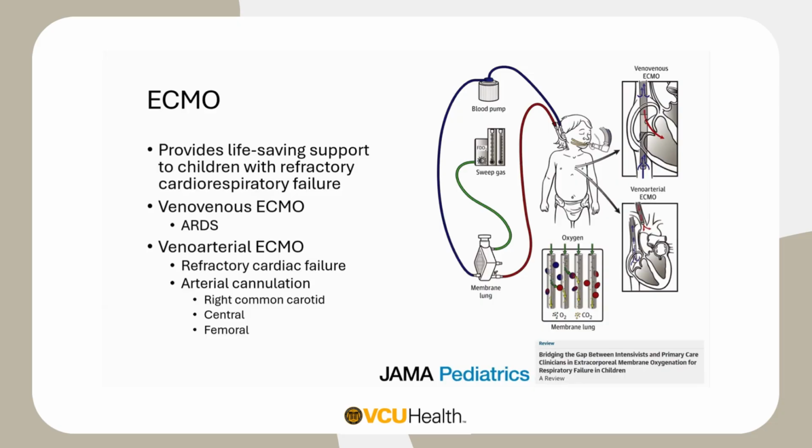Generally speaking, veno-venous ECMO is used in situations where we have severe respiratory failure, so these may be patients with acute respiratory distress syndrome or just severe respiratory dysfunction. And then VA ECMO we will commonly do in refractory cardiac failure in patients requiring extracorporeal life support, and so forth.